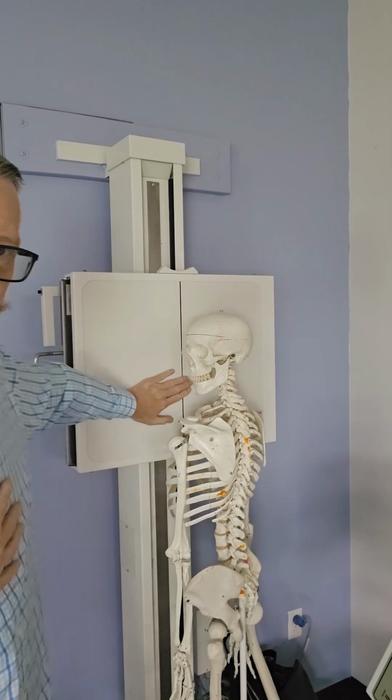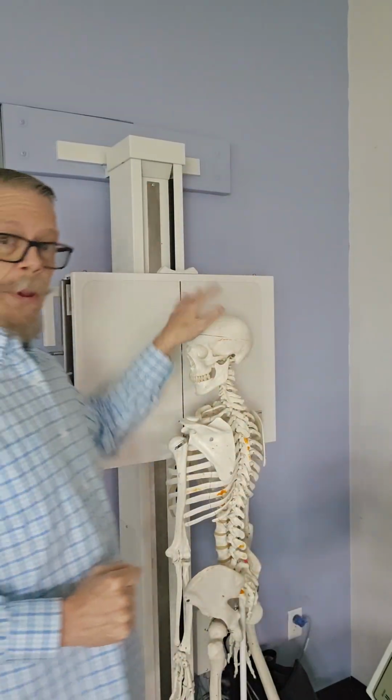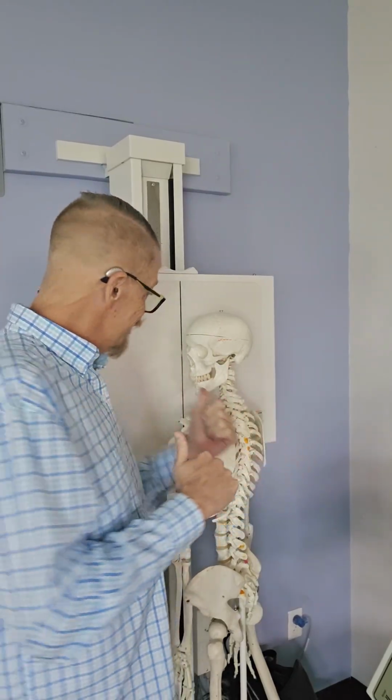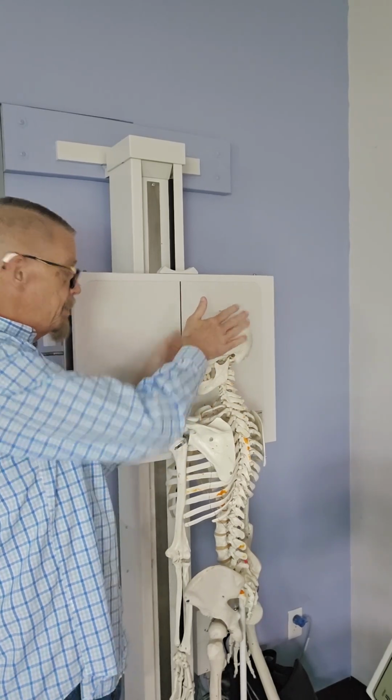I have my patient with their head placed in as close to a true lateral as I could get it. I have a 25 degree cephalad angle on my tube. The amount of angle is gonna depend, but we want no more than 25 degrees. That could be a combination of angle on our tube and tilt on our patient. This patient, I can't tilt his head. Normally, I would want to tilt the head towards the image receptor a little bit, maybe 10 degrees, and then I would use a 15-degree angle on my x-ray tube. So a combination of those two, not to exceed 25 degrees.